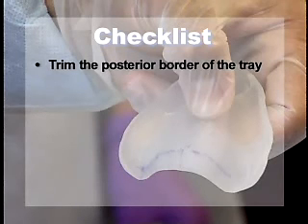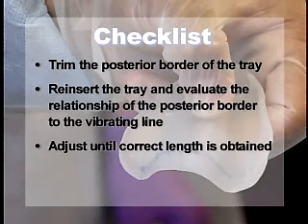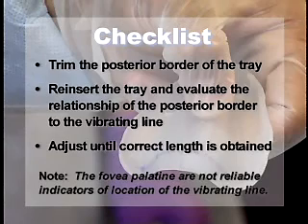Trim the posterior border of the tray to the transferred line using a burr designed for trimming acrylic. Reinsert the tray in the patient's mouth and evaluate the relationship to the posterior border of the vibrating line. Adjust until the correct length is obtained. Note that the fovea palatini are not reliable indicators of the location of the vibrating line.